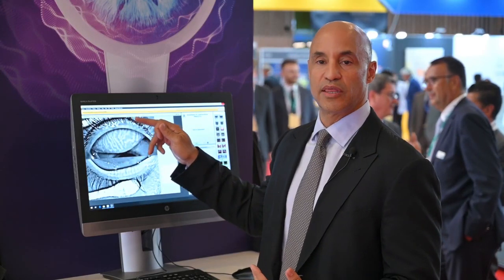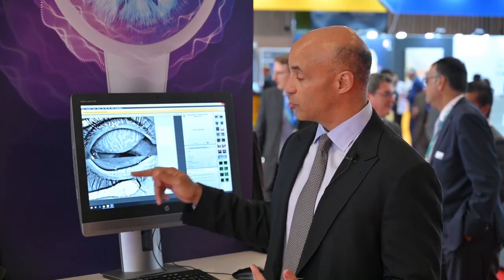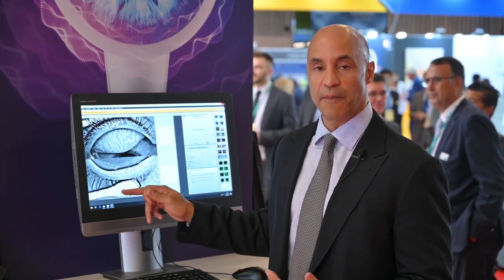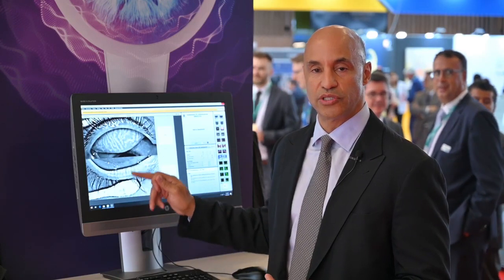Another thing you can use with the Keratograph 5M is get pictures of the lid margins. What I'm looking for there is patients with telangiectasias going to these Meibomian glands. If they have telangiectasias, you know that they have some rosacea. 80% of patients with rosacea have Meibomian gland dysfunction in dry eye. So that's another telltale sign.